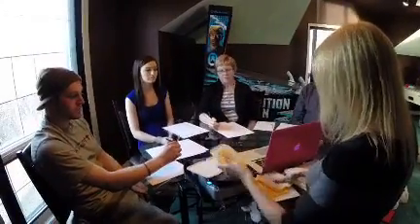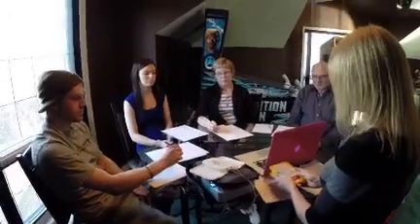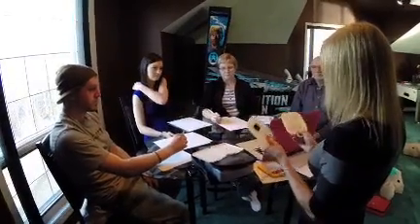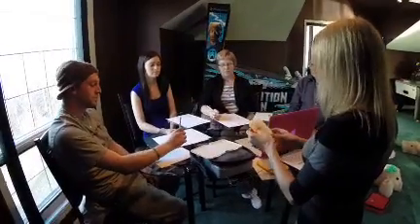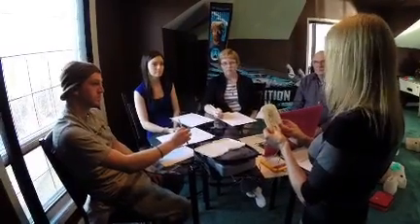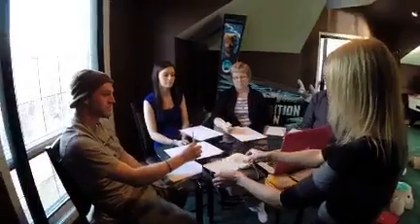Okay? If you don't have child pads, do you think that you can use the adult ones? Yes. If you don't have child pads, you can still use the adult ones. Just make sure that you remember one in front and one in back. Don't follow the pictures for the adult ones. They will only shock, it's a smart machine. It won't shock more than it needs to. It analyzes and it knows the body size of the person.